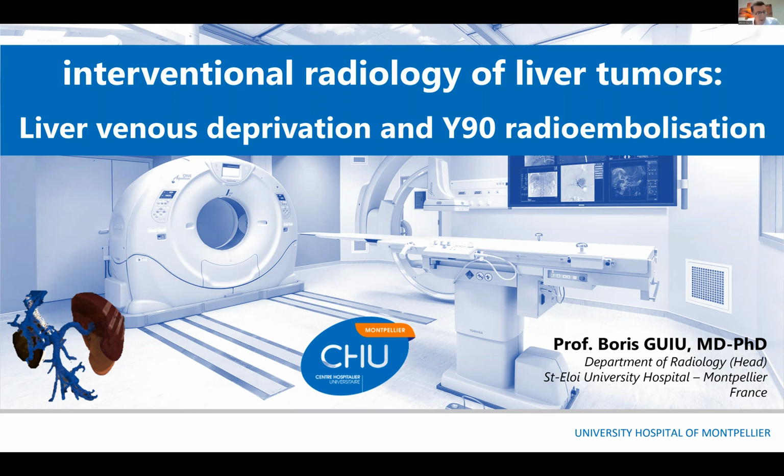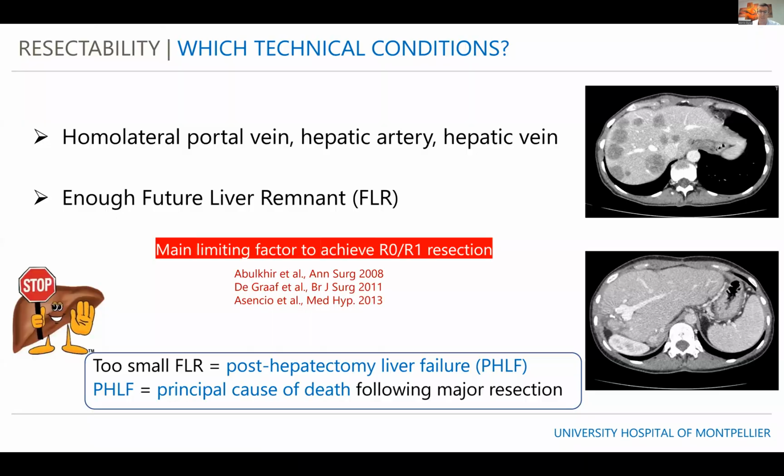So here, I propose to review with you two different topics, because we have many very interesting topics, including the newest one. And when we discussed with Professor Panaro, he got the idea to mainly focus on liver venous deprivation. And the second topic, a little bit oriented, as you will see, on Y90 radioembolization, especially for HCC.